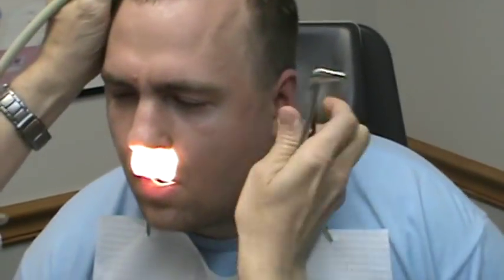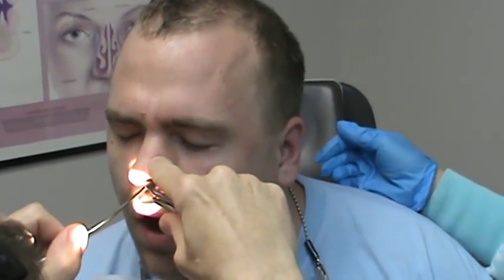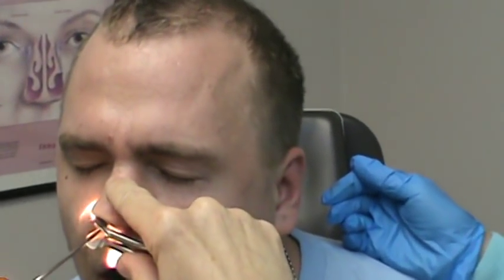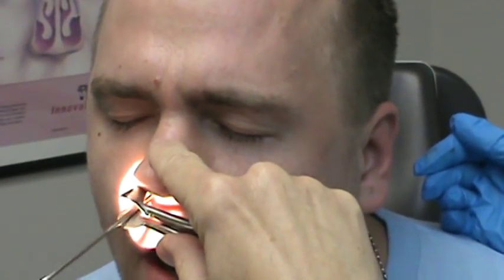Now just slow your breathing down. I'm going to look at your nose here. Just slow your breathing down. You got it. Almost done. All right, so that's it. And now you can breathe through your nose.